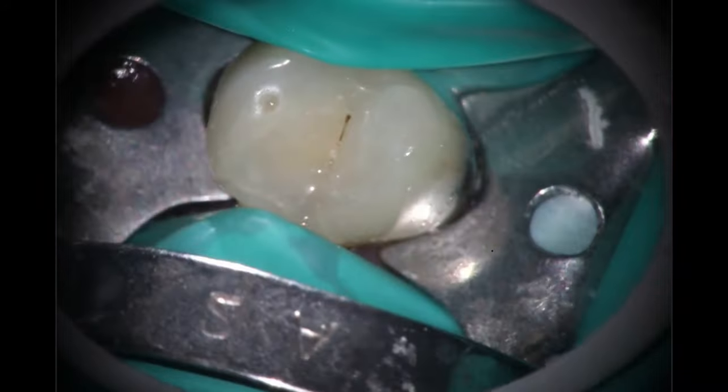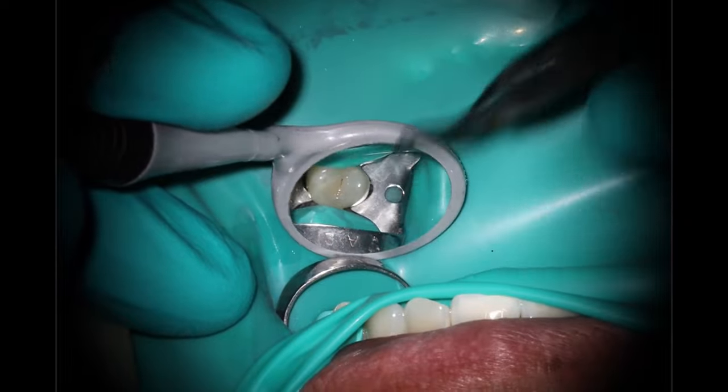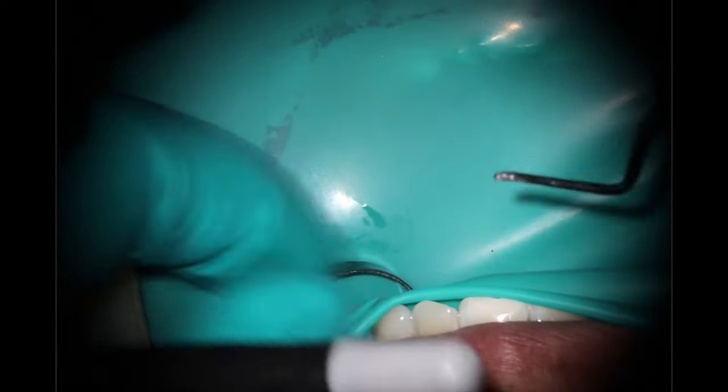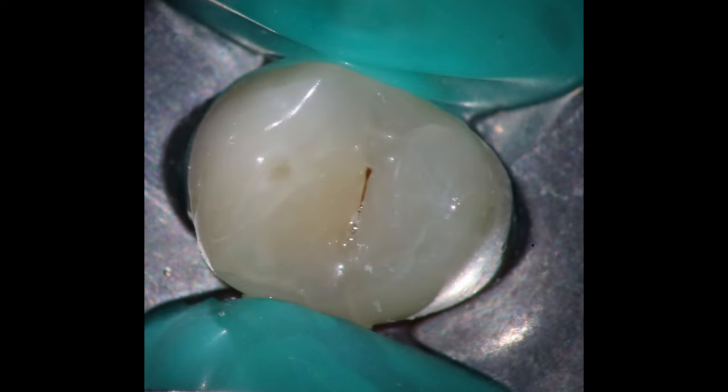Showing you that process — make sure you always invert your dam, that's one of my pet peeves. As you can see, not really much going on as far as this tooth goes. I'm going to try to plan out the access to be as conservative as possible. This tooth will eventually get a crown, because I know who the general dentist is on this one and they do like to crown these teeth. But if we can keep it small enough, sometimes you can get away with not needing one, or there's no crack. Kind of a controversial subject.